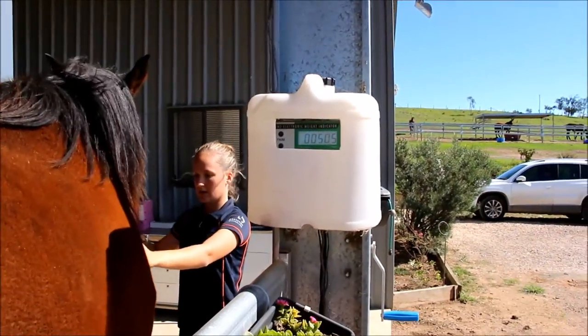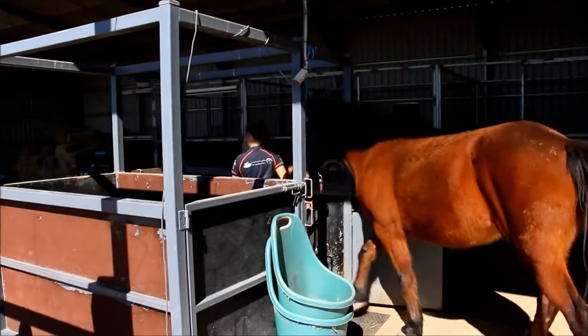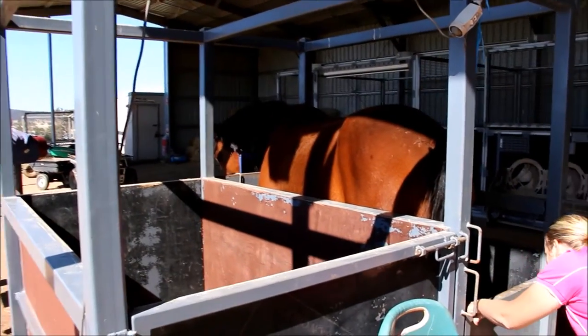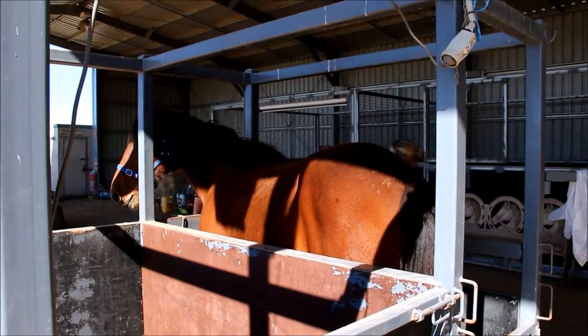After they're weighed, we then pop them into the crush and ultrasound rectally to determine where they are in their cycle. A lot of people arrive with their mares already in season, which is great, but if not we still ultrasound them to see where they are in their cycle.